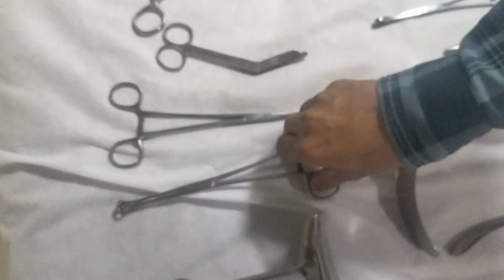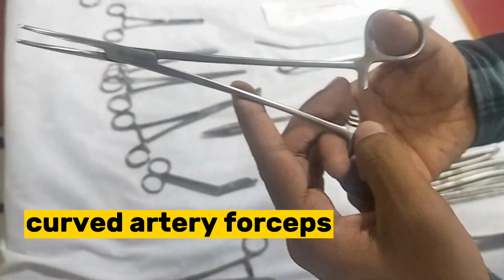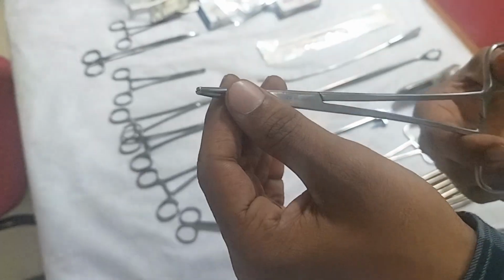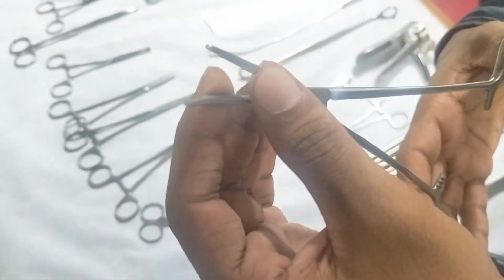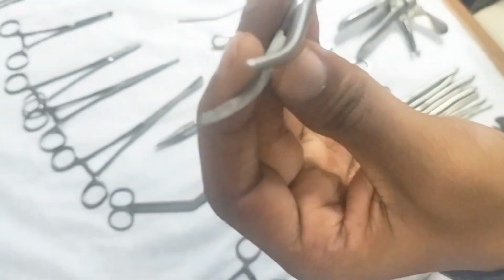It is non-traumatic. Next, we got curved artery forceps. In the proximal part we can see a ratchet locking mechanism, a long shaft again, and in the distal end it is a curved artery forceps. And you can see the serrations in the distal end on both sides. Okay, these are transverse serrations.